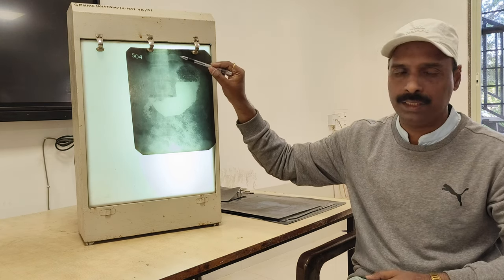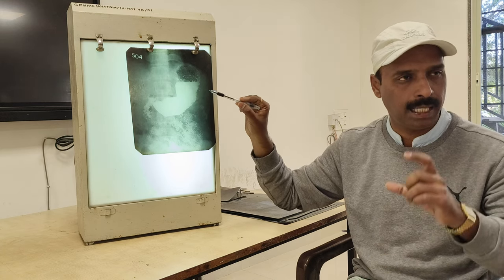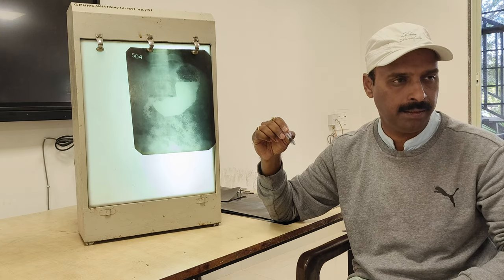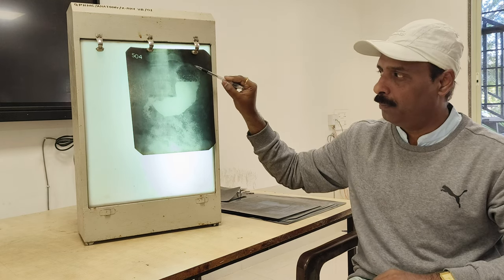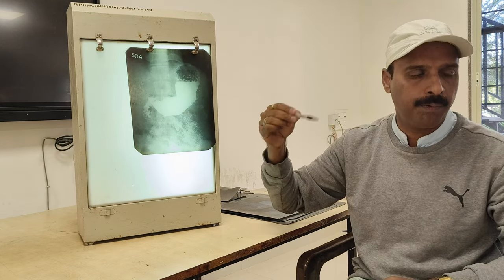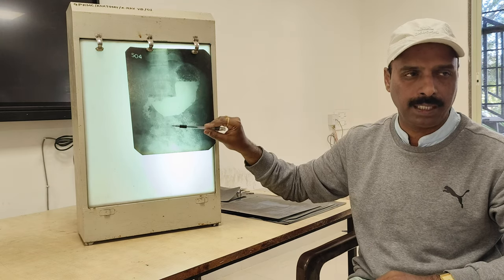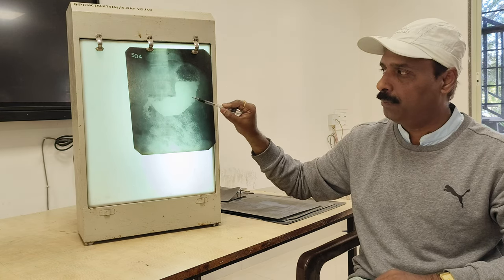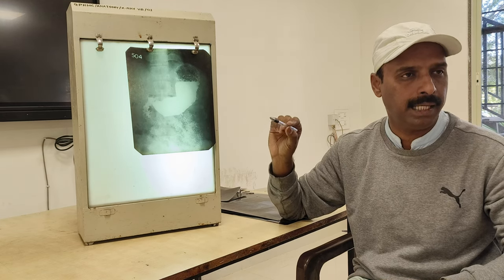When the patient is allowed to drink the barium sulfate, which I have told you is milk-like, we take the x-ray only while drinking. That gives the shadow of the esophagus, which is not seen here. But here, after the follow through, where the barium is filled in the stomach region, you can see almost all the outline of the stomach filled with the barium. So that is what we call a barium meal x-ray.